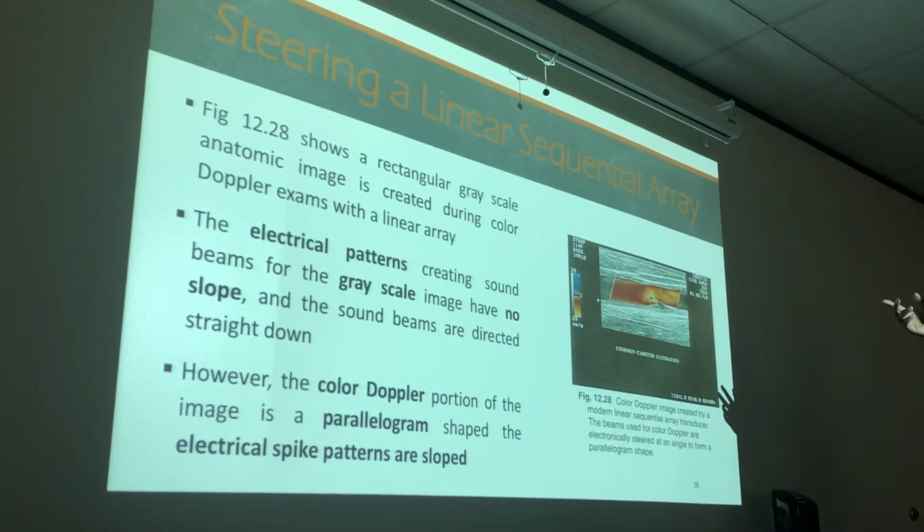So the reason we have to use angles for Doppler is that we're usually using it for blood flow. We have to make sure this blood is either coming towards the transducer or away from the transducer. That's how Doppler works. This is my transducer beam shooting down right here, and think about your main portal vein.